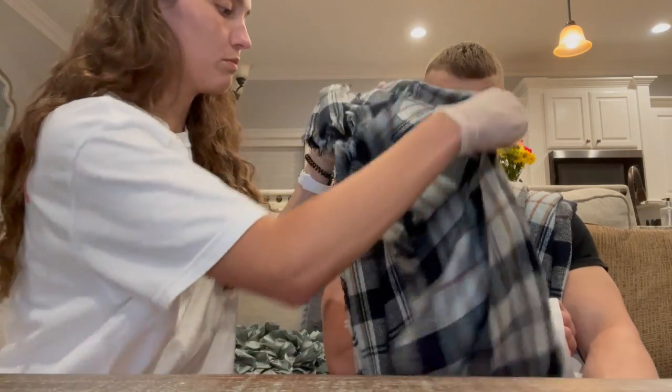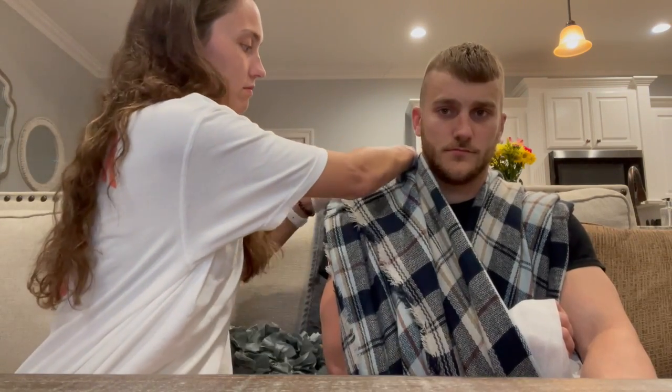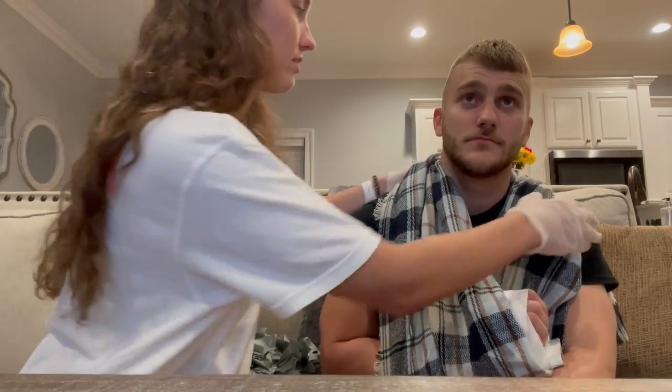Make sure that you pull the upper end of the bandage over the uninjured shoulder, and then bring the lower end of the bandage over the forearm. Next, you should bring the end of the bandage around the neck to the uninjured side and tie to the other end at the hollow above the collarbone on the uninjured side.